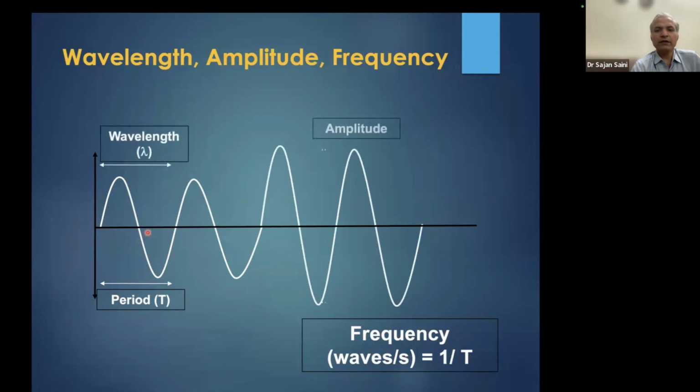So this is the wavelength. The other physical attribute is amplitude. This particular wave has a certain amplitude, and once the positive and negative deflections are increased, the amplitude or energy is higher. Most of the time we will be dealing with frequency and wavelength, and they are important to understand because the wavelength is responsible for penetration. The larger the wavelength, the larger the penetration.